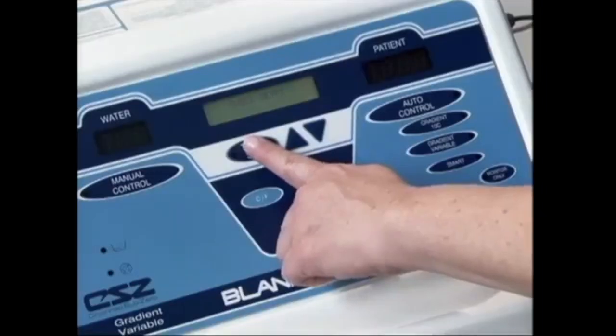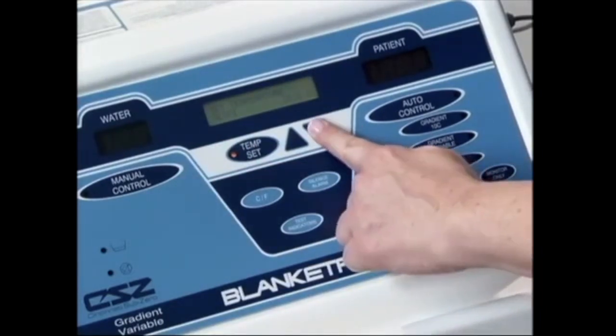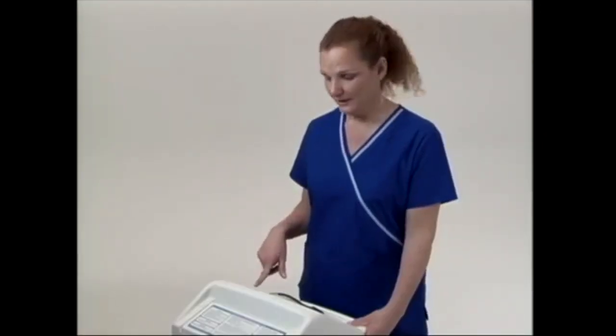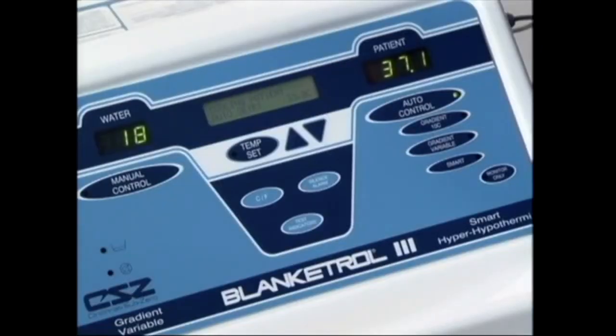To use the Blanketrol 3 in the automatic mode, you must have some sort of temperature sensing device in your patient. Then, all you need to do is hit the temp set button in the center of the console. Using the up and down arrows, set the patient's desired temperature. Then press the automatic control button. This will circulate the water around the patient at a maximum of 42 degrees Celsius and a minimum of 4 degrees Celsius.